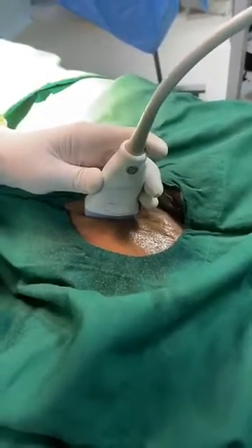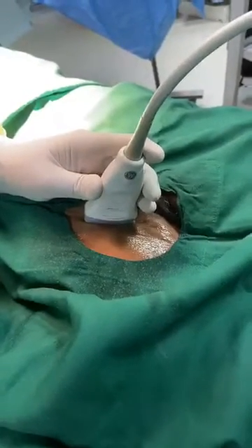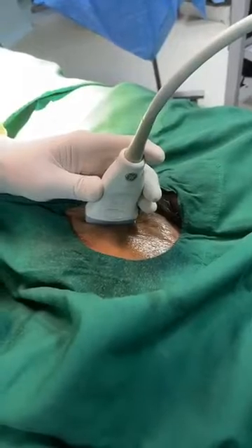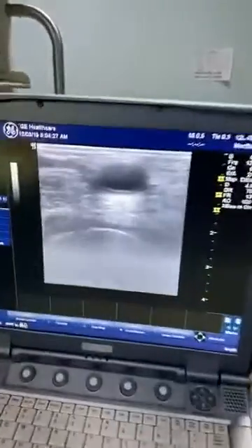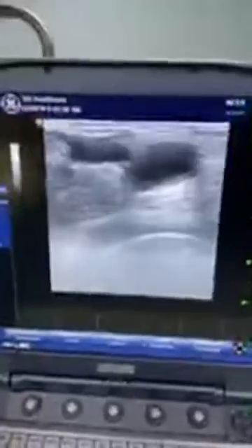Good morning friends. This is the patient for TURB — transurethral resection of the bladder tumour. I have put the probe just above the inguinal crease. If you see on the screen, you can see this is the femoral artery and femoral vein.